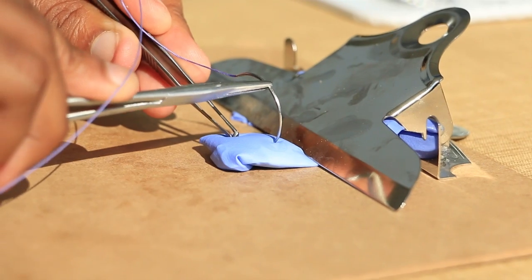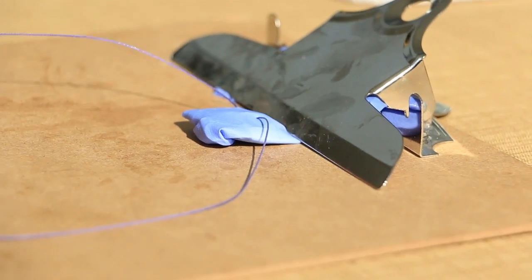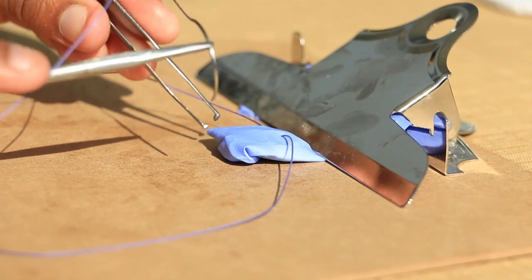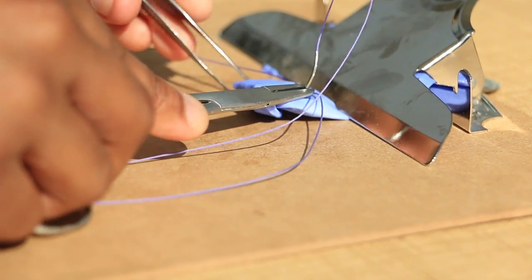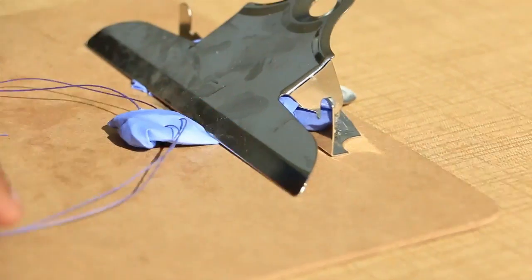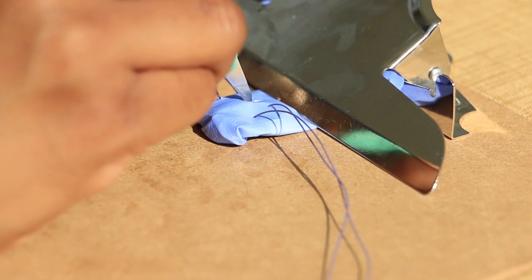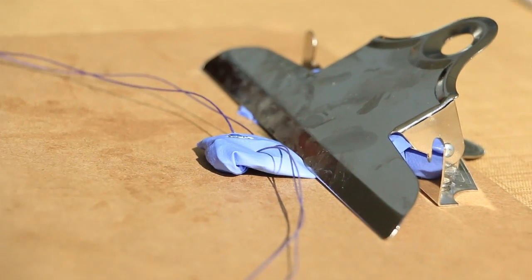With the cyst still intact, the cyst wall is grasped and a suture is delivered through and through. This is repeated 3–4 more times depending on the size of the gland. An incision is then made over the gland in the usual fashion, outside the hymenal ring and approximately 2–3 cm long, taking care not to cut the previously placed sutures. The cavity drains spontaneously and may be irrigated with saline solution, and if necessary, loculations can be broken up with a hemostat.